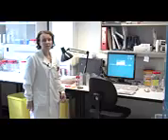This is the feces bench. This is where we process stool samples for the causes of food poisoning, such as Salmonella, Shigella, Campylobacter, E. coli O157. We also look for Vibrio cholerae. We would also look for causes of antibiotic-associated diarrhea. We would test for Clostridium difficile.